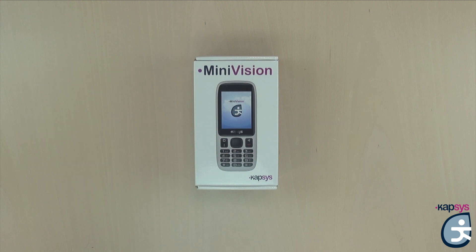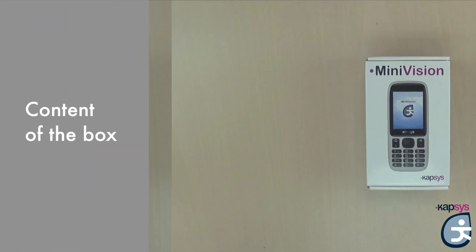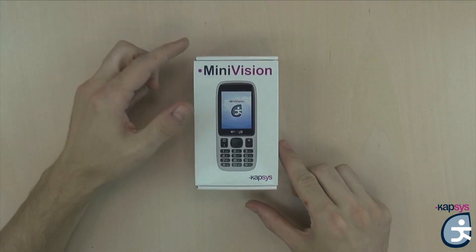In this video, we will present you the contents of the box, the functions of the different keys, and the first startup. So let's go ahead and open the box.